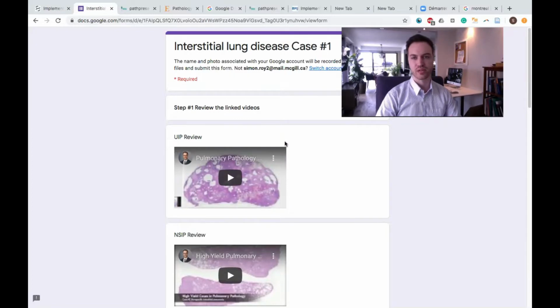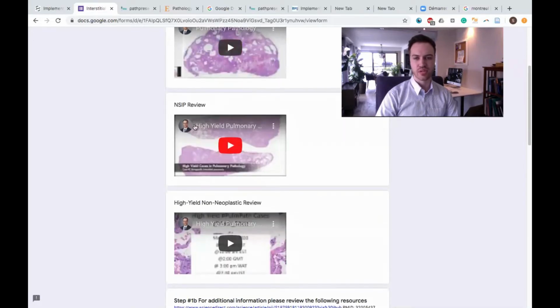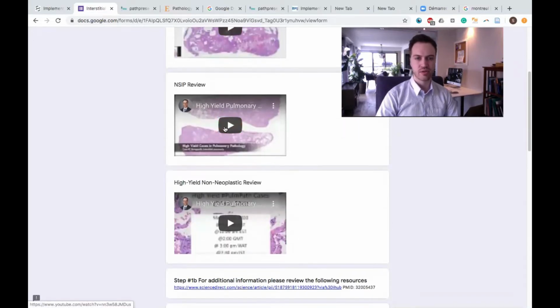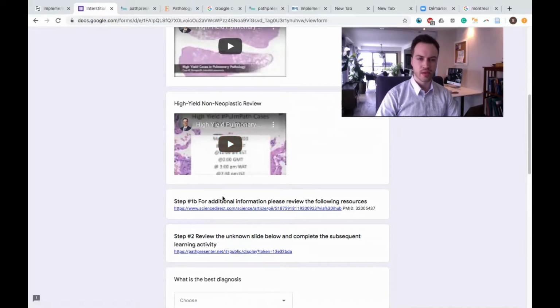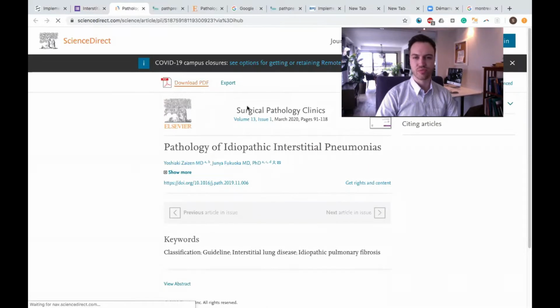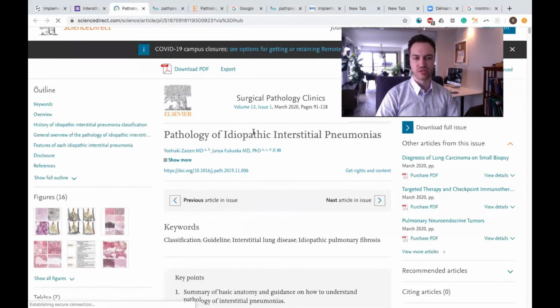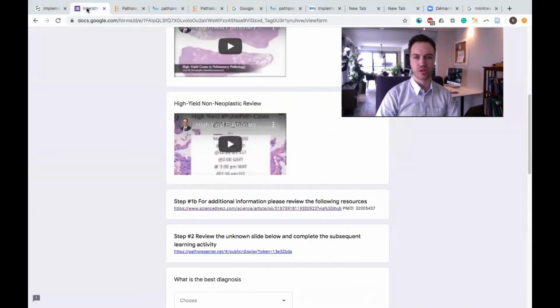It's more practical based. So this is an exercise here, a Google form that Dr. Cecchini sent me. First, I have these linked YouTube videos about UIP, about NSIP. I can click on those and review those. I did that earlier. I also have this high yield non-neoplastic lung pathology review, which will be super helpful. And I really like this little touch here, which is a review article from Surgical Pathology Clinics about idiopathic interstitial pneumonias. I can review that and refer to that while I'm doing the homework.